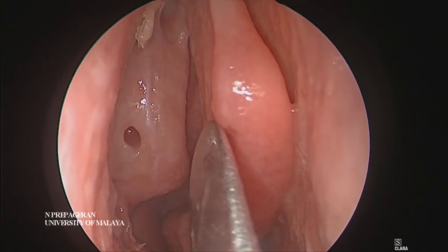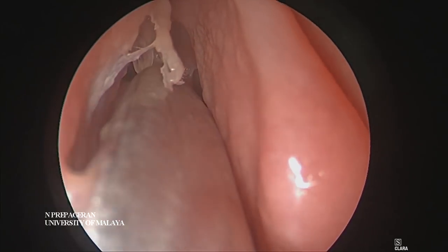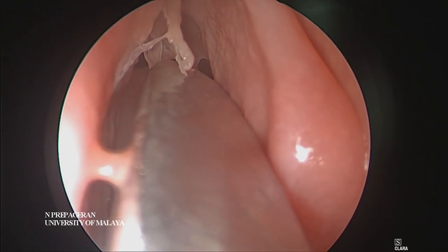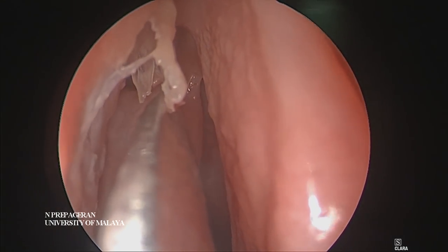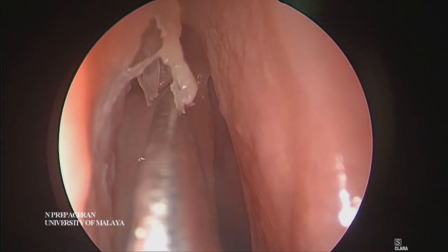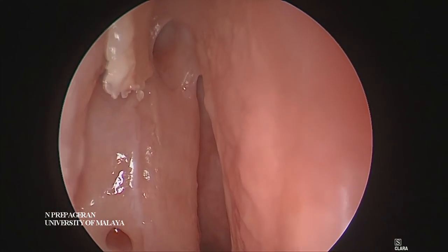That is the bulla coming into view. So at this juncture, either we can go on to do gate number two, which is the bulla, and gate number three, which is the ground lamella, or we can go straight to the frontal sinus. If you go straight to the frontal sinus, this is called an intact bulla technique, which means you climb the bulla into the frontal sinus. The frontal sinus will always be between the uncinate process — that's the remnant of the uncinate process — and the bulla. And there's always a vertical bar that comes between the uncinate process going up to the bulla region. The frontal sinus will always be slightly medial to the vertical bar unless the uncinate process is attached to the orbit.